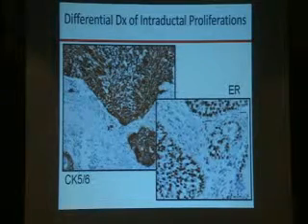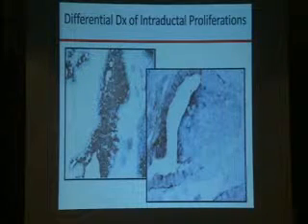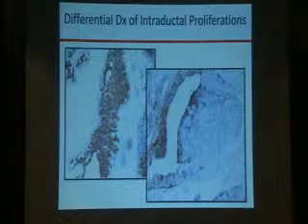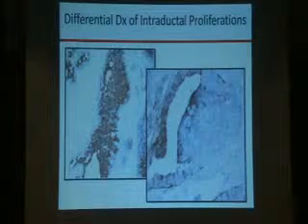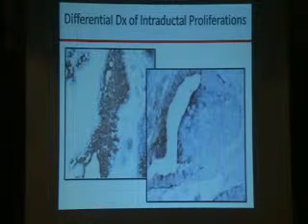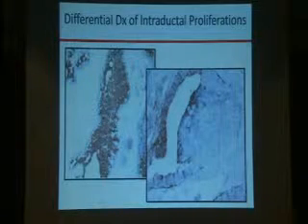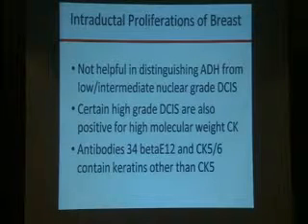So again, this was a hyperplasia without atypia. Identification of these patchy areas of lack of staining for cytokeratin is the hallmark for atypical hyperplasias. And again, in my opinion, 90% of the time, these areas are appreciable on H&E staining.